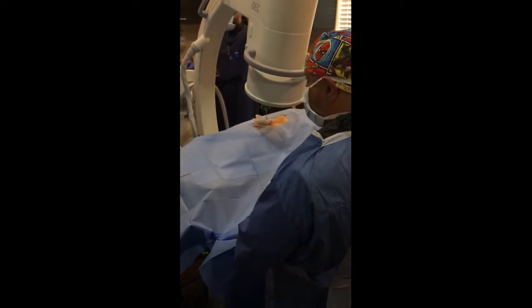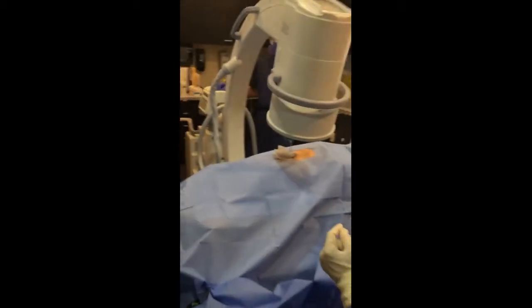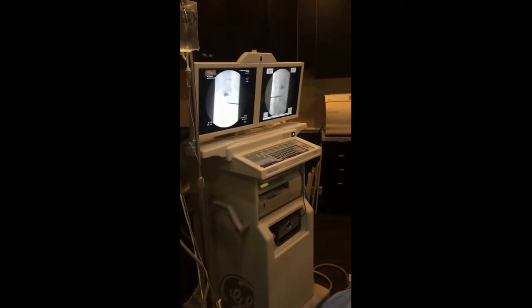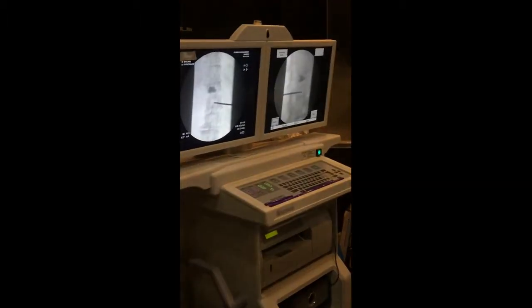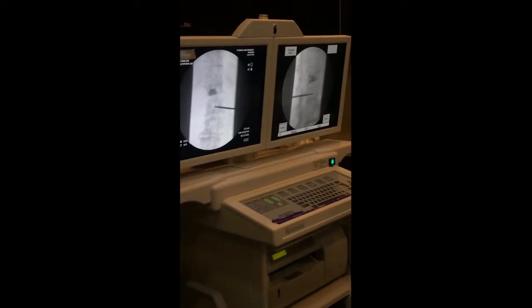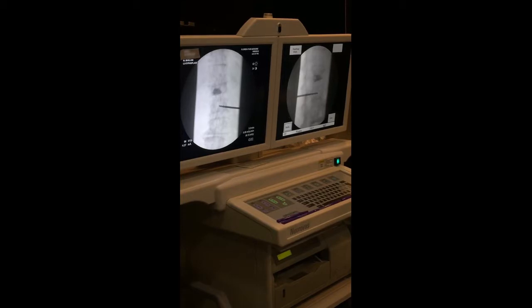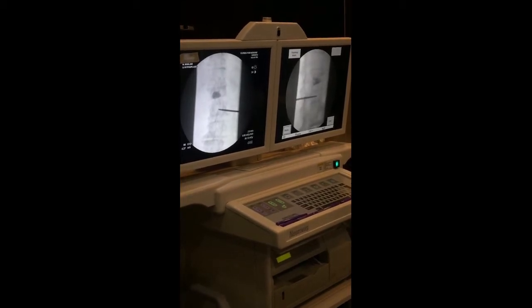So she is rotated a little bit, but you can see on that image now we're getting a beautiful picture, and it's already starting to cross the midline as it is. Go ahead and zoom in on that, Lee, a little bit. You can see that it's already starting to cross the midline as it is on that vertebral body. And we still have about another 1/3 that we can cross on that space. So thank you very much.